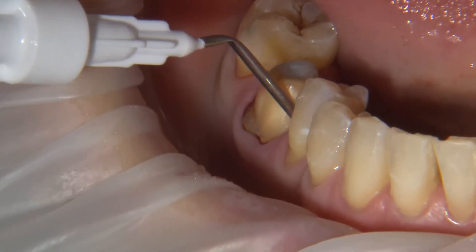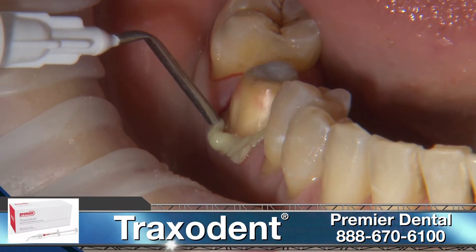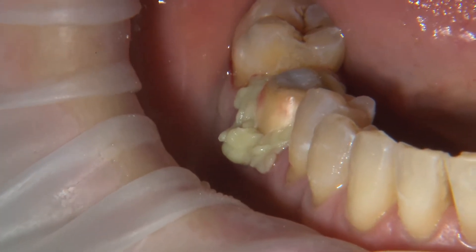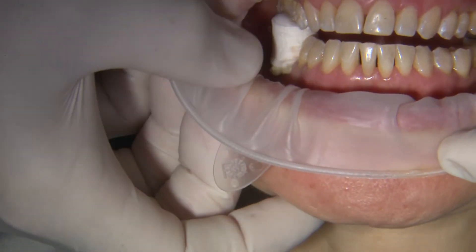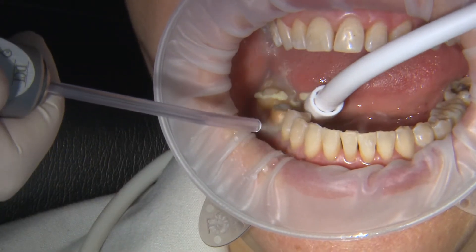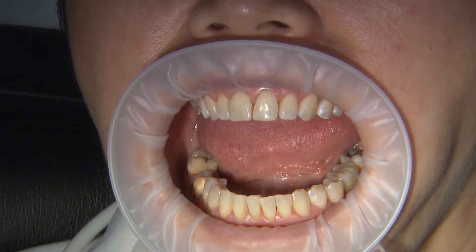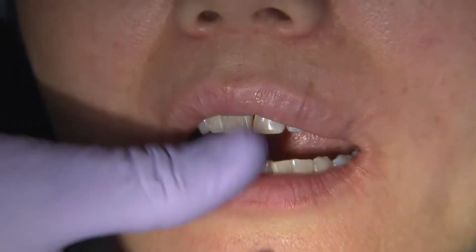The next technique involves a retraction paste application — a brand such as Traxodent works well and has built-in hemostatic qualities. The paste is applied around the margin and injected into the sulcus as much as possible. A compression cap is placed over the paste and the patient is told to bite together with pressure for two minutes only. The most important part of paste retraction is the complete removal of all remaining paste before starting the scan process.